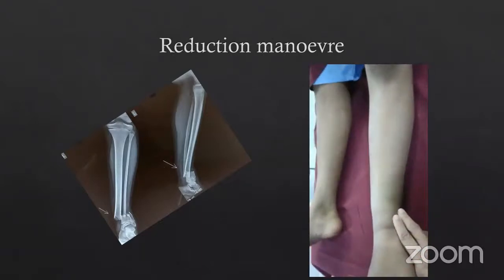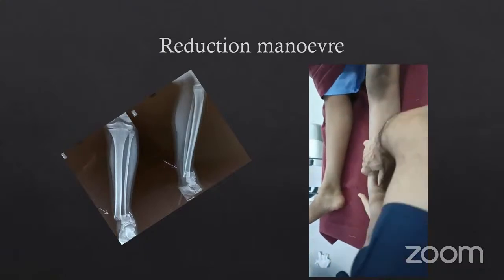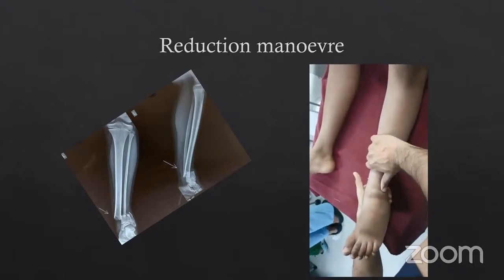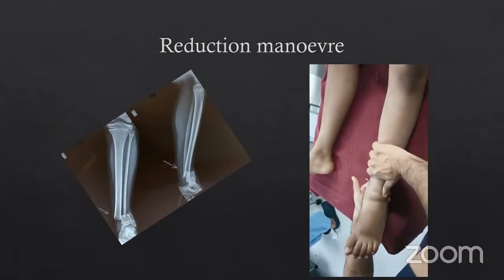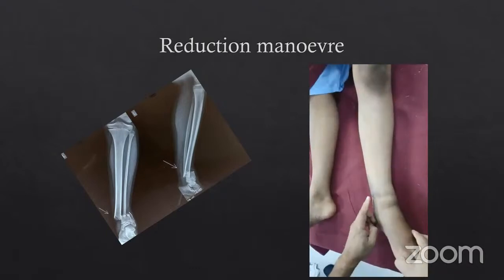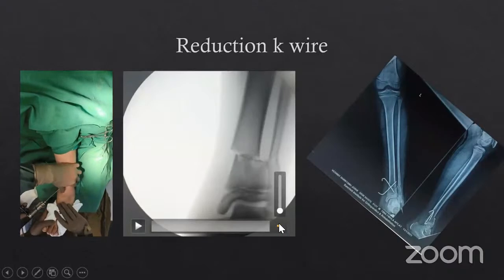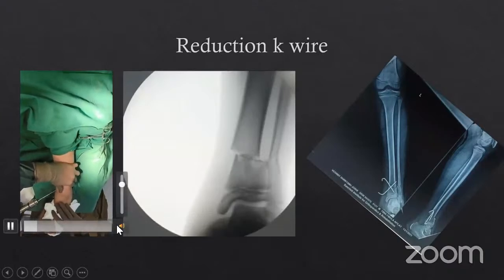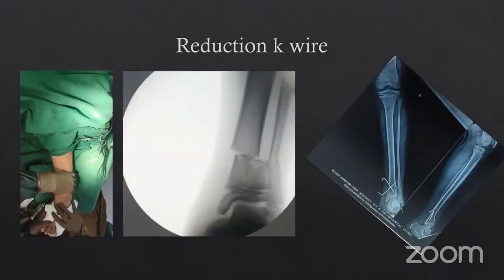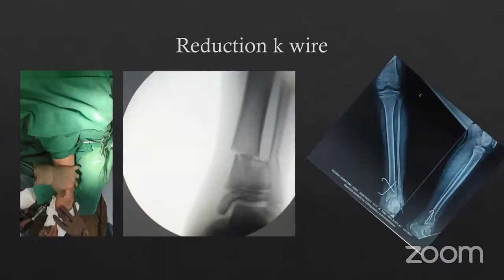So what we did was exaggerate the deformity. As I said, hold the heel and distal fragment, and I exaggerated the deformity. And then I gently milked both the fragments down, and then I pushed it into varus. And then we did an image shoot. And you can see this. And then I am doing a K-wire stabilization, a percutaneous K-wire. Cross K-wires just to hold the pieces together.